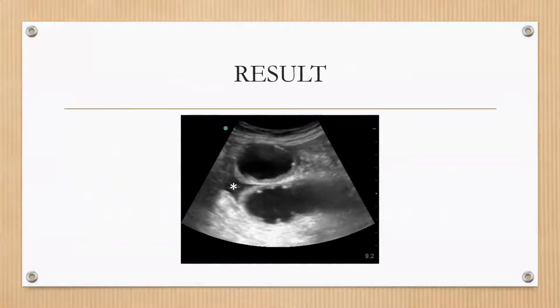So for A, normal aortic diameter. C, collapsed IVC, less than 50%. U, no air, no free air. And P is for localized free fluid with donut sign. So you can see that on the first image.